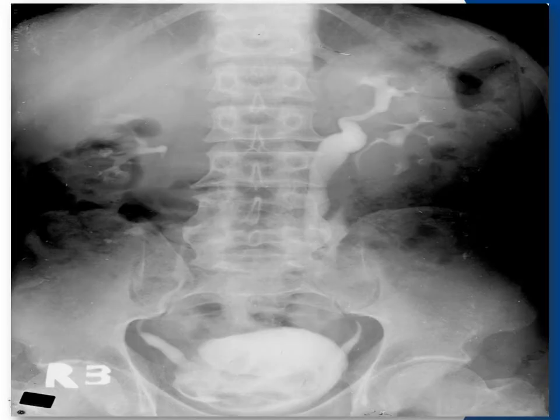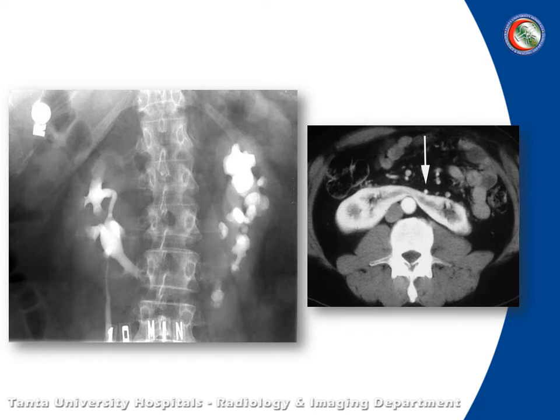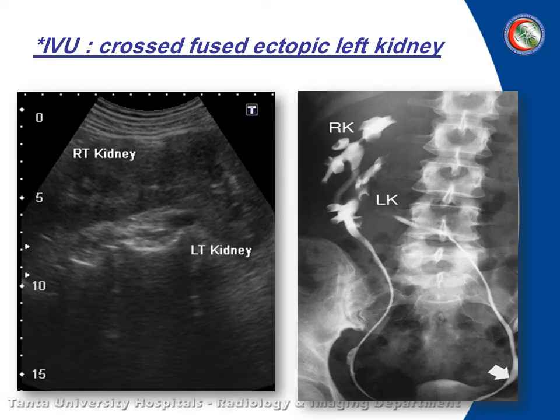As you can see here, there is unilateral duplication with dilatation of the upper moiety. Horseshoe kidney — as you can see, horseshoe kidney on contrast study and CT. Crossed fused ectopic left kidney.